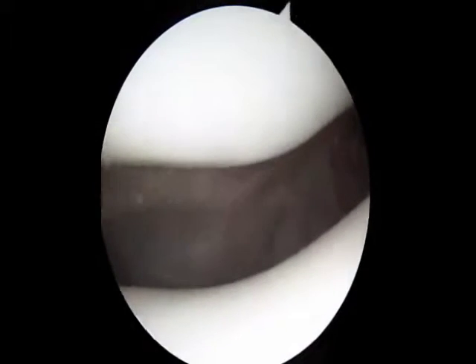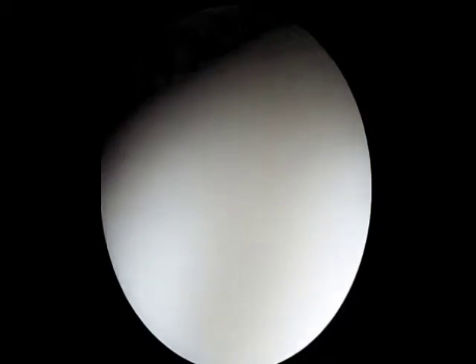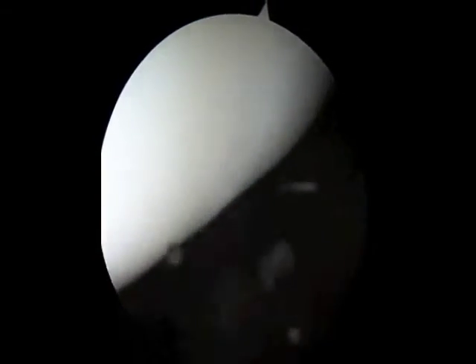Here we can see the patella at the top and the trochlear, which is the groove that the patella sits in below. The white cartilage seen here is normal healthy cartilage.